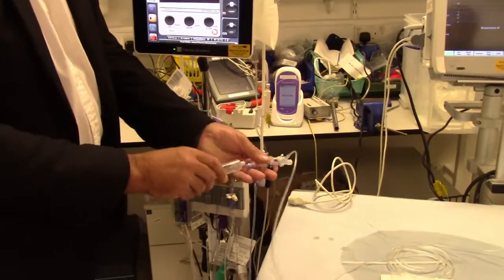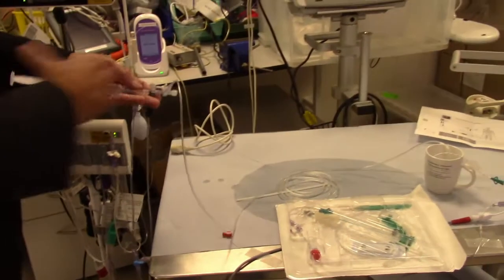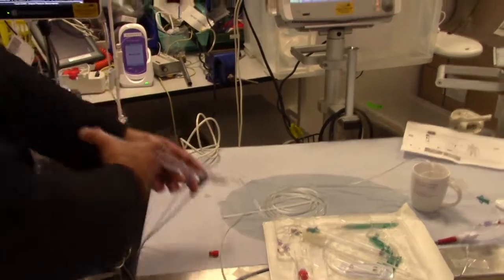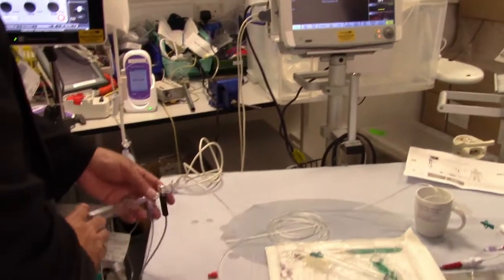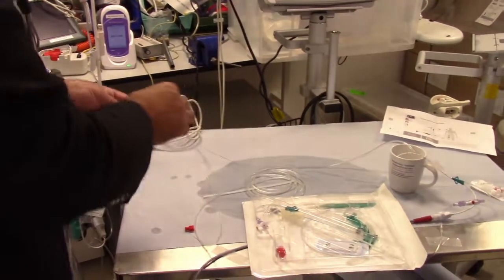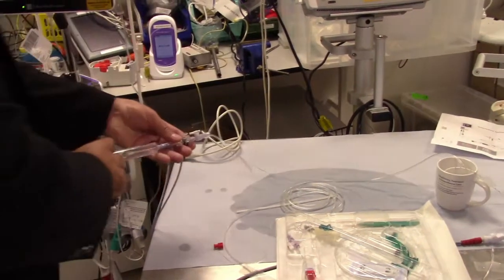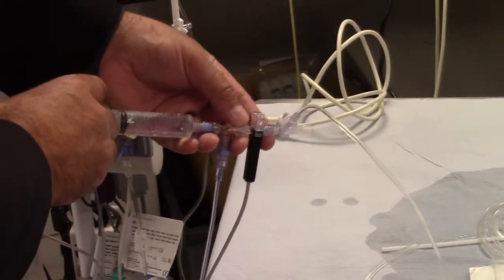Thank you. I'm going to have to do a bit of both. Have we got another cold saline? Just another. Oh, fine. Okay. No, actually, it's there. So, yeah, everything connected. Oh, you can inject. Okay, fine. You might want to shut that off though, because it'll go flying off the other way. Right. So as I do the injection, I'm doing the right way.